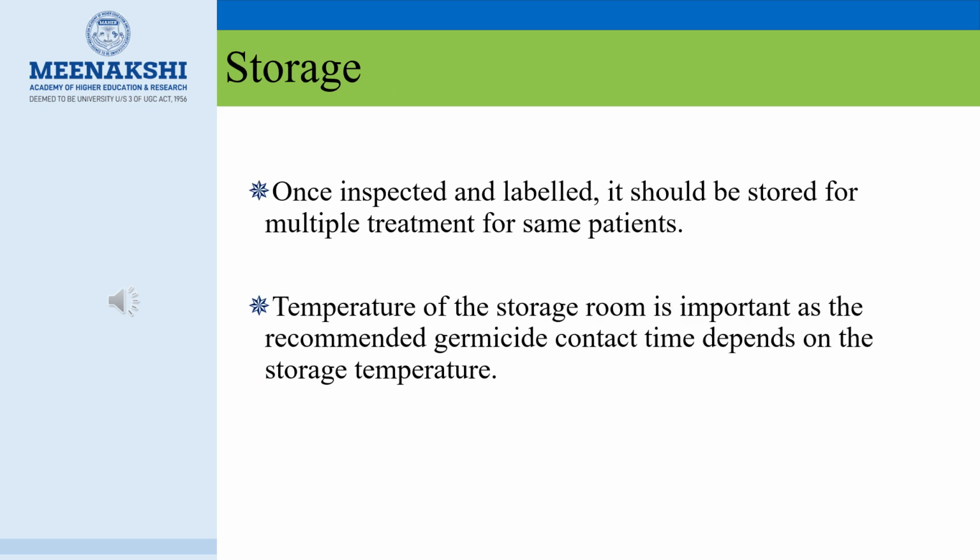Storage. Once inspected and labeled, it should be stored for multiple treatments for the same patient. Temperature of the storage room is important because the germicide contact time depends on the storage temperature.